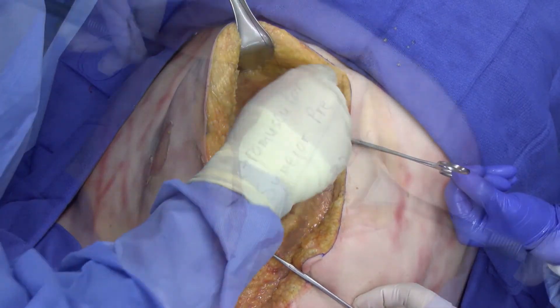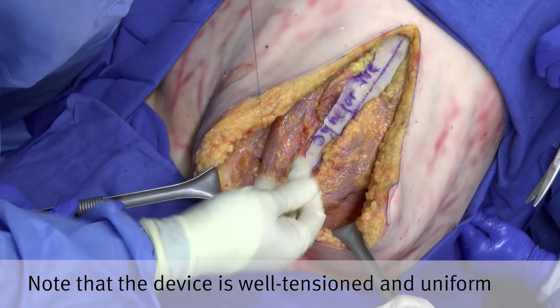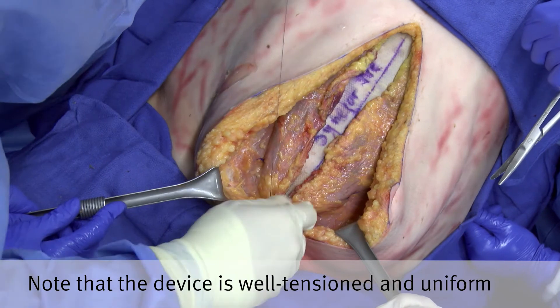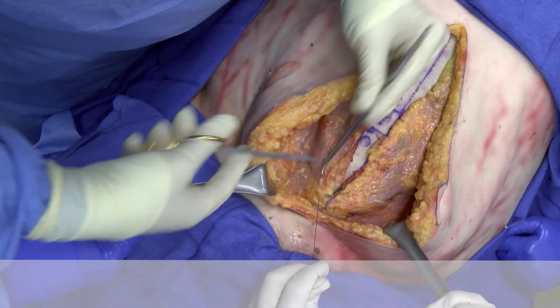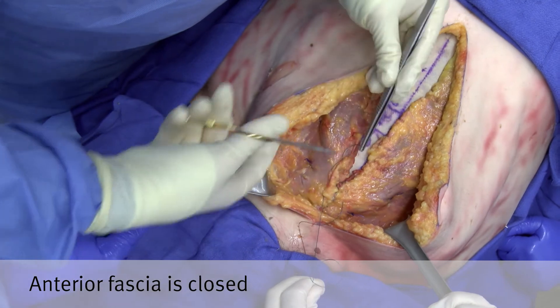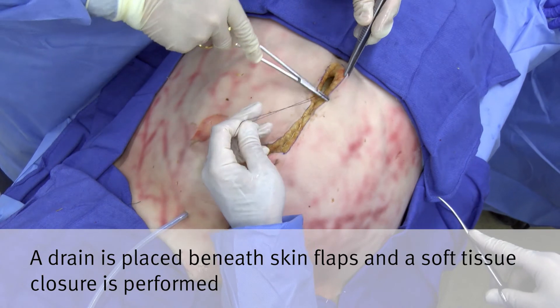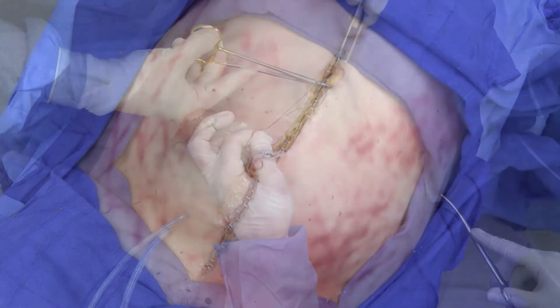These transfascial sutures are now tied down and the repair has been completed. The anterior fascia is now easily re-approximated with a running continuous stitch, completing the abdominal wall reconstruction. Note the coaptation of the fascia and the well-tensioned mesh. The soft tissue is now closed.